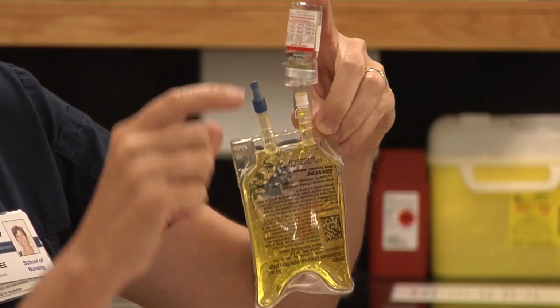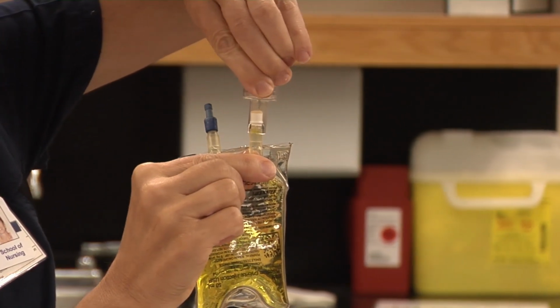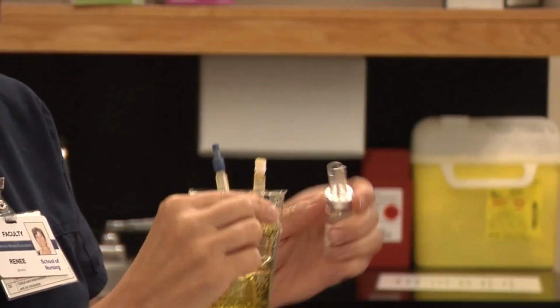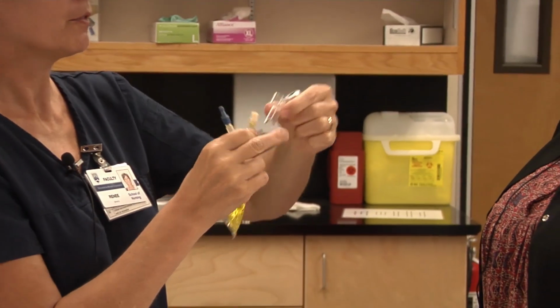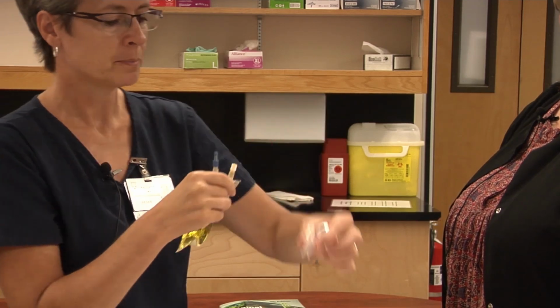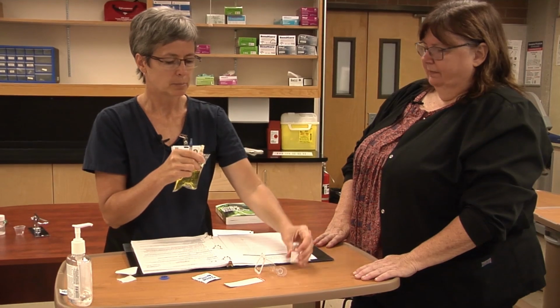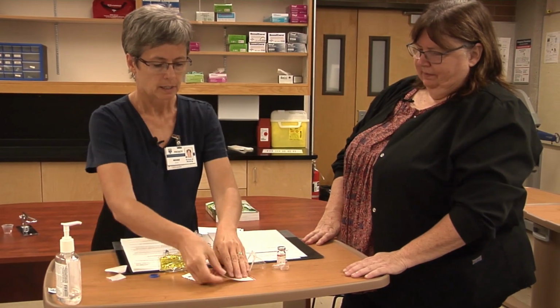Okay, so our vial is empty. It's in here. Now we're going to just remove everything off of here. If you just remove this and leave it on, there's an open pathway and things can leak out. Does that go in the sharps container? This becomes a sharps. We're going to keep our vial here for a second.